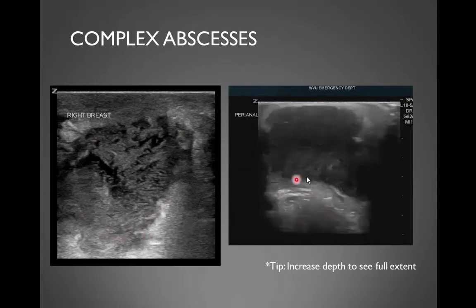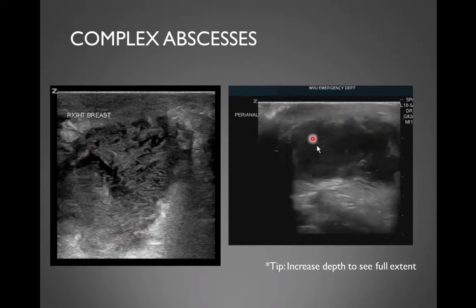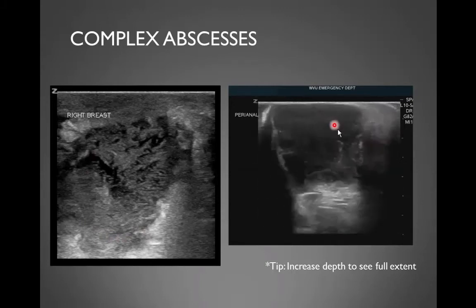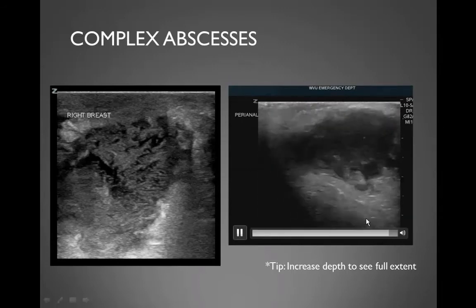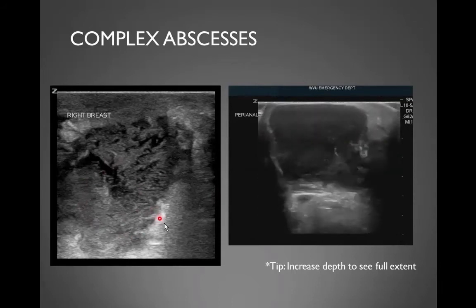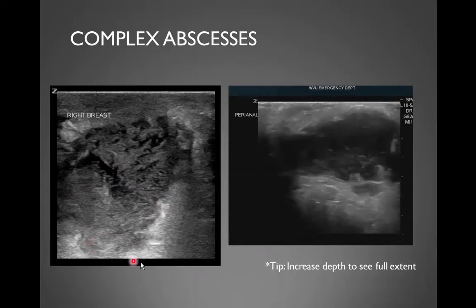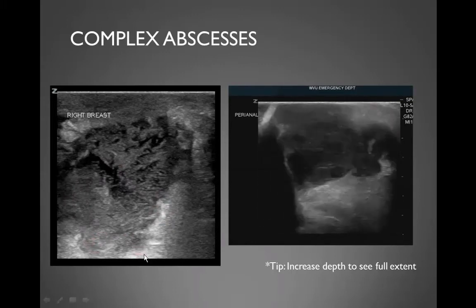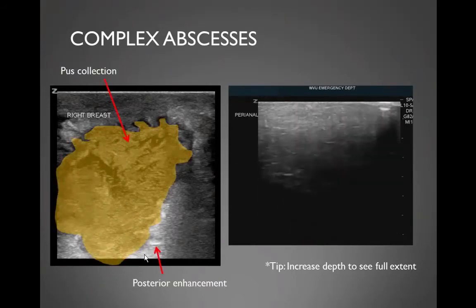It's nasty. And here's one again. See, it's not simple black fluid. It's a lot more echogenic than just plain old water would be because of all the protein and thick material that's in there. And just a tip, this is a good example where we did it poorly. You want to increase your depth so that you can see the full borders and get a good idea of what's behind that abscess and really know how far it goes. And I'll try to outline that one there for you.